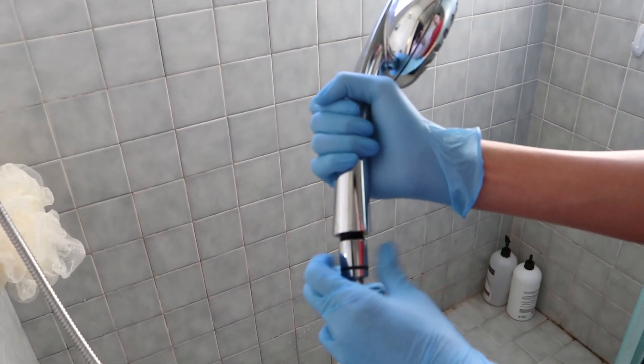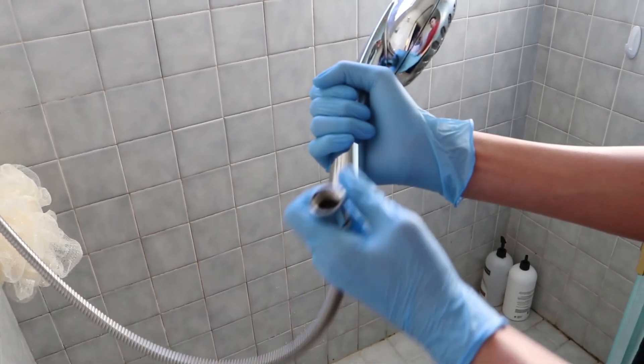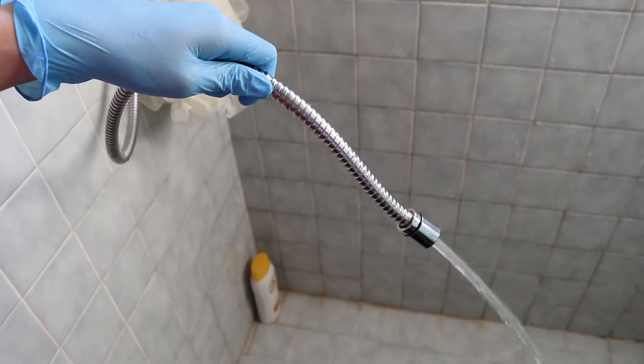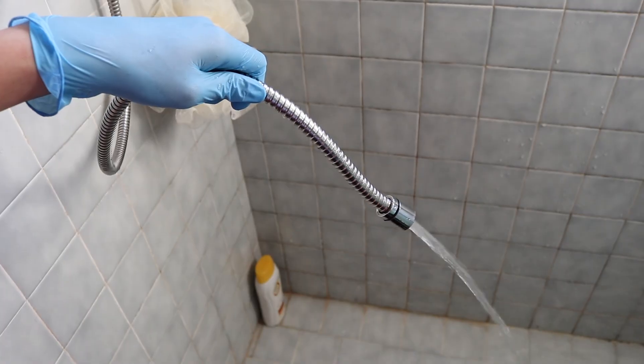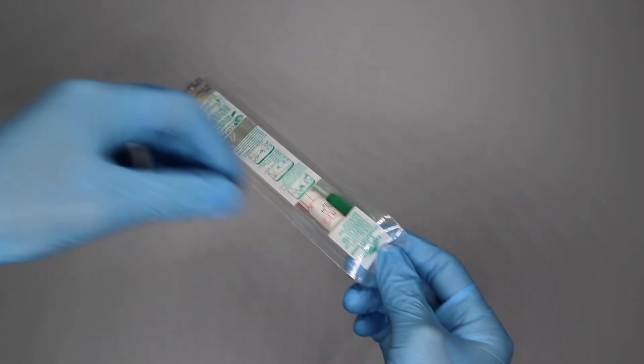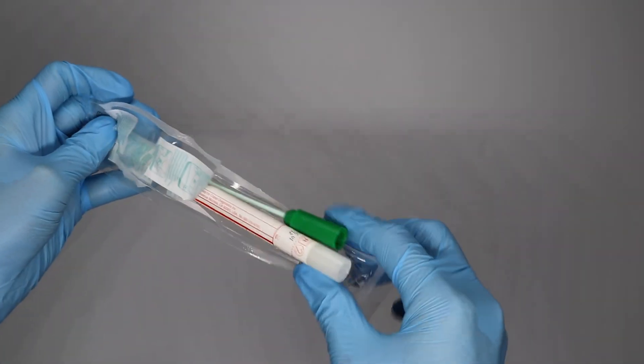Remove the shower head or the aerator of the faucet before examining it. Turn on the water for a few seconds to moisten the pipe, then turn it off. Open the swab package carefully and remove only the swab, making sure not to touch the tip.